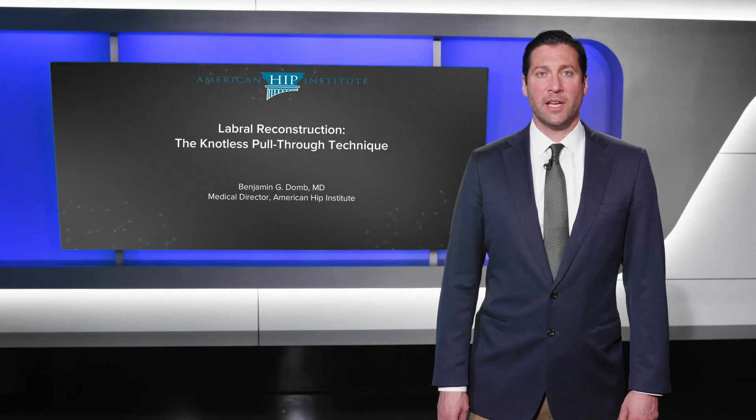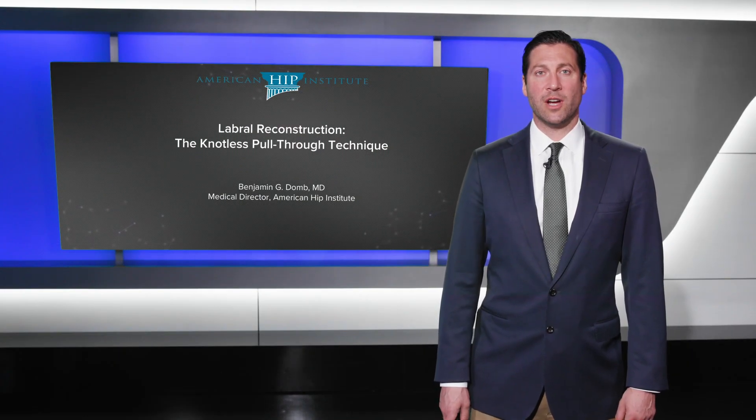My name is Benjamin Dohm and I will be presenting labral reconstruction in the hip using the knotless pull-through technique.